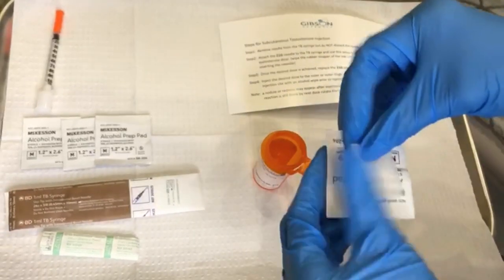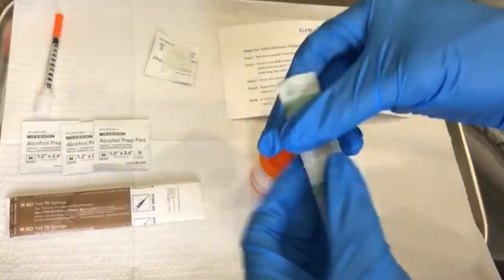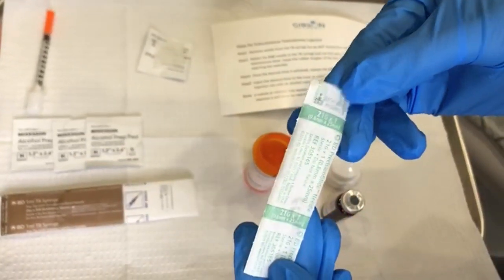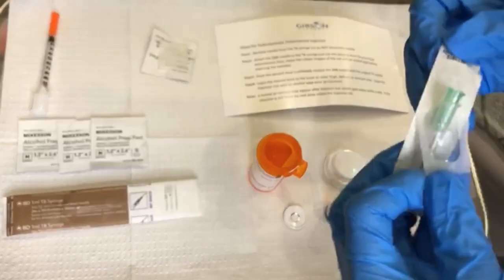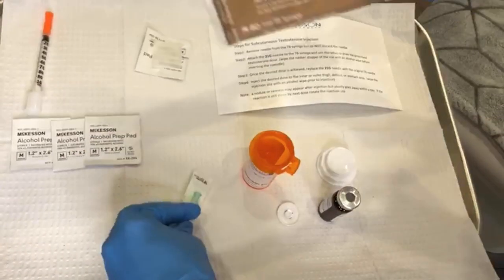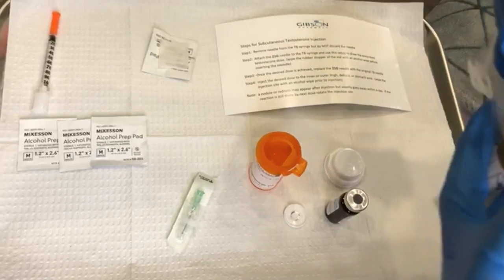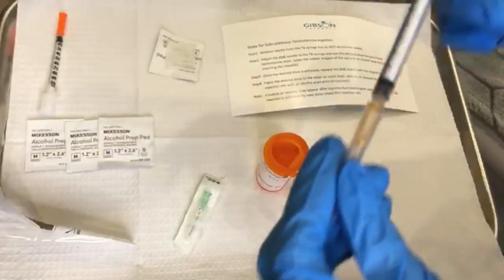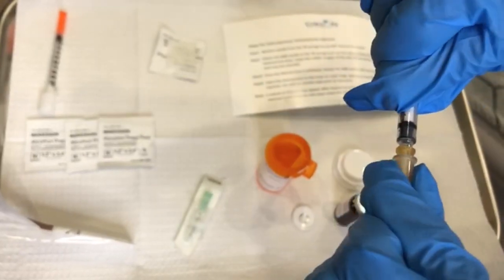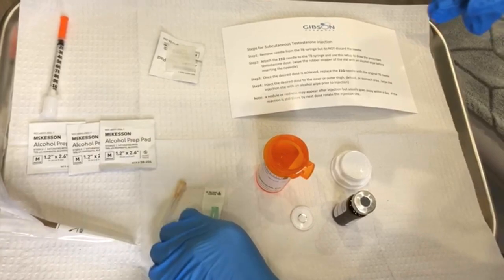Now we are going to take the 26 gauge needle and unscrew it from the syringe and attach the 21 gauge needle. Go ahead and peel back the 21 gauge needle wrapper so that it's ready to swap out. We're using the 21 gauge to draw from the testosterone vial because the testosterone is oil based, and it is a little bit easier and faster to draw with the 21 gauge needle.